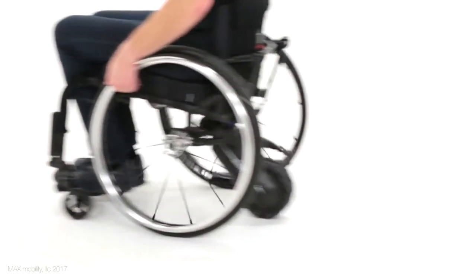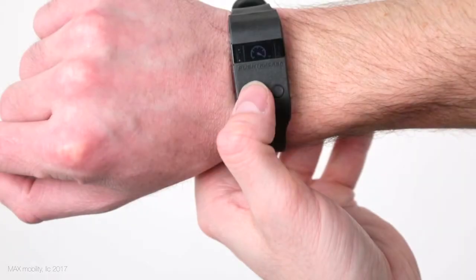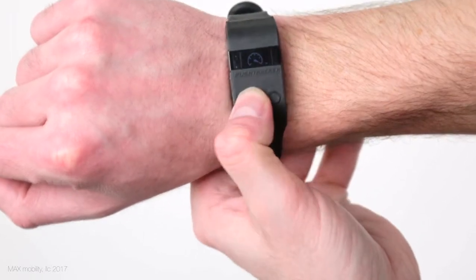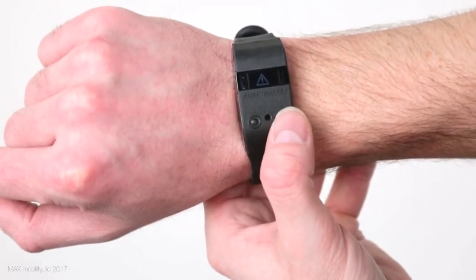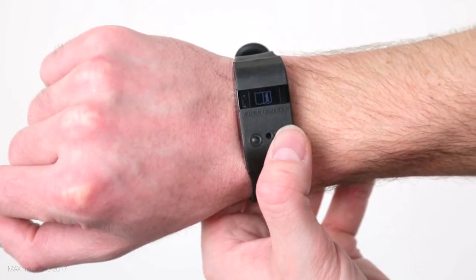As said before, the PushTracker allows for individualization of the SmartDrive power assist. Selecting the SmartDrive settings icon gets you into this submenu. Here, you are able to change the maximum drive speed that the SmartDrive is able to go. We must stress for your safety: always look in the SmartDrive and PushTracker user's manuals before changing any SmartDrive setting to understand exactly how the changes you make will affect the performance.